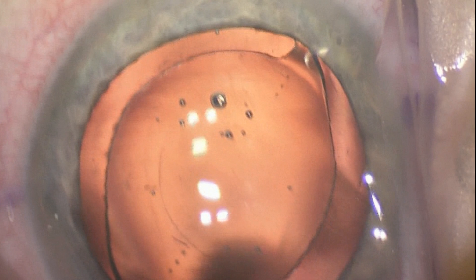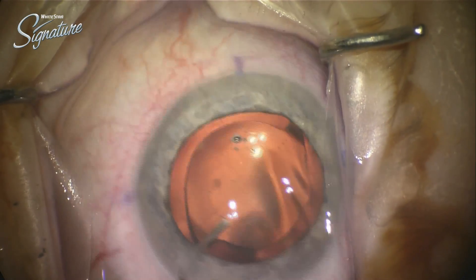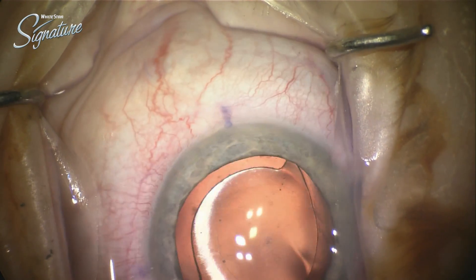Here we see a really nice alignment — a little bit of parallax error, you see — but the alignment with the corneal marks versus the toric alignment marks were absolutely fantastic.